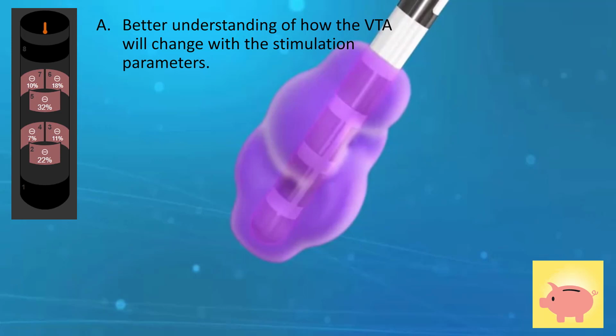Further, with so many contacts, it will take much time and effort to test each one of them individually, and you will save valuable time by focusing on the actual area of interest. You might, for example, discard all options involving the internal capsule directly and choose a VTA in the actual target area before proceeding with more detailed evaluations.